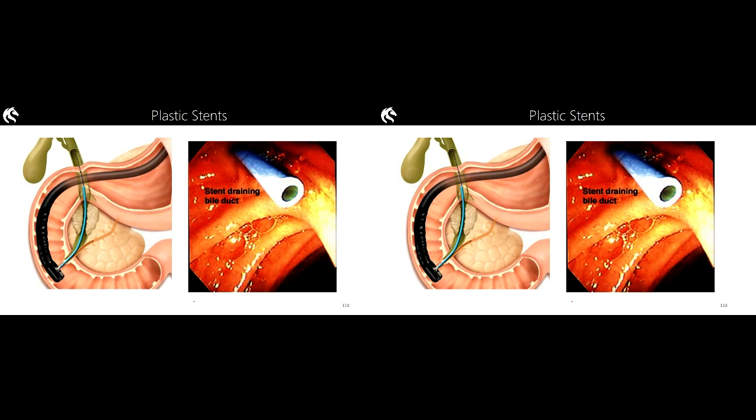Now, the word stent, we're using it in the context here of the bile duct, but a stent can be used in vasculature as well, okay? So you might have had a family member or a friend who had a heart attack and they did a stenting of that blood vessel. What we're talking about there is inserting a metal tube into that vascular structure just to keep it open. All right, but let's talk about the common bile duct to start off with.